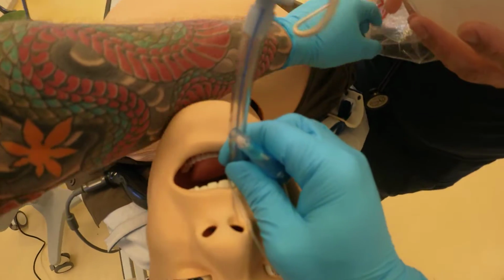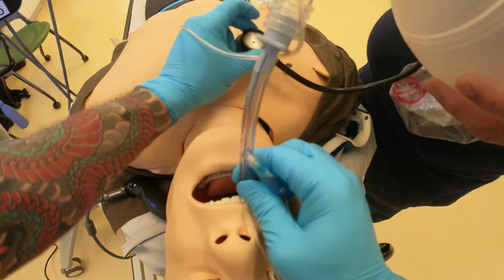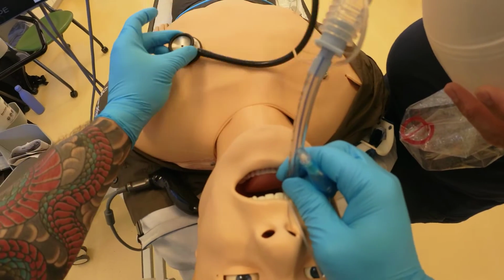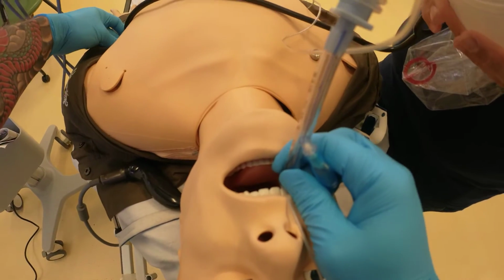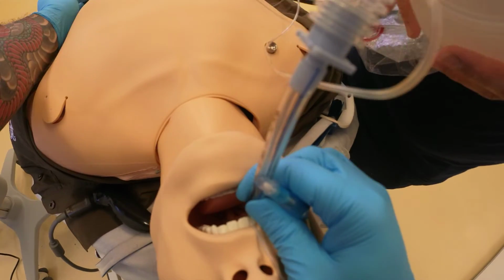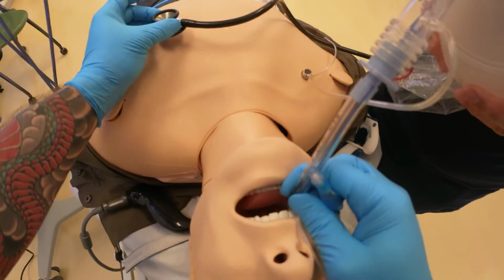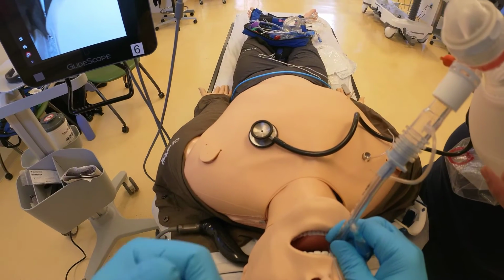So we don't want to auscultate, I'm going to take the head, we don't want to auscultate here, and here, right? Because I'm listening for bilateral lung sound. So the best place is mid-axillary on both sides. And to be honest with you, I don't even bother checking the epigastric sound because I saw it go through the vocal cords. So that's the main takeaway from this.